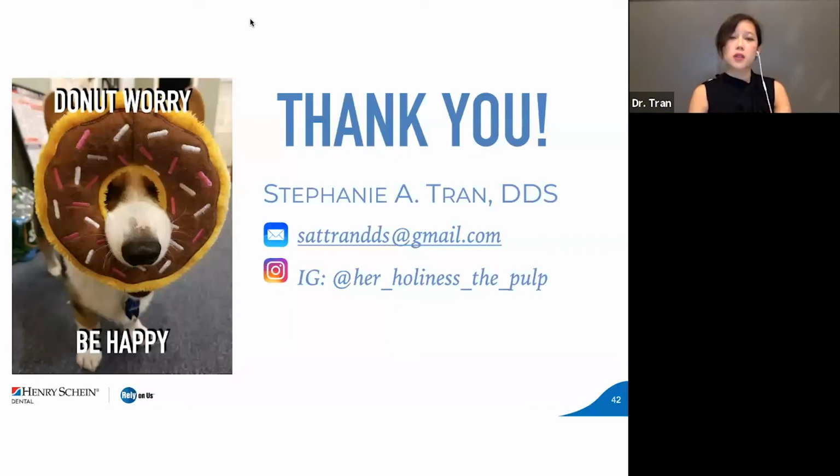But let's say you absolutely need a post for a certain case. In general, the concerns about metal posts, with the exception of certain cast posts, but with prefabricated metal posts, is that because the metal is a different modulus of elasticity from the tooth structure itself, there's going to be concerns of that difference causing fractures in the tooth. So fiber posts in general are going to be related to fewer root fractures than a metal post. However, it does depend on how the post is placed.